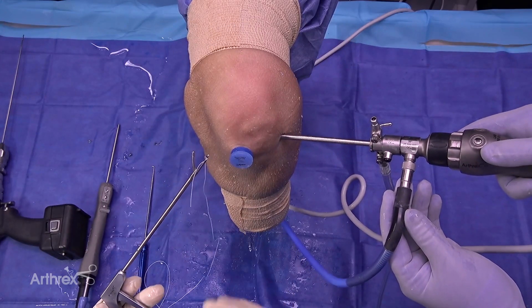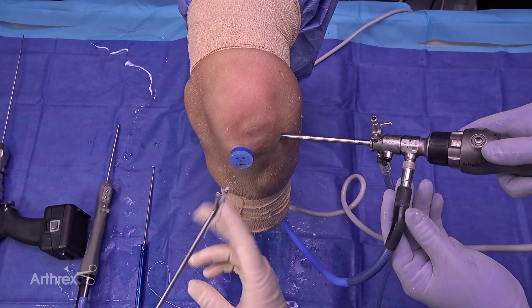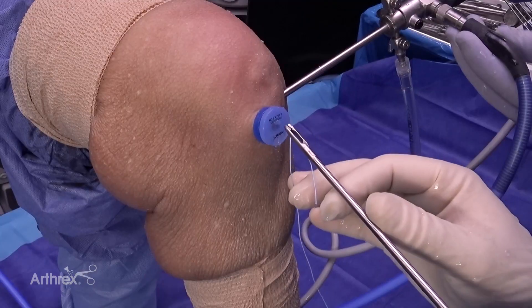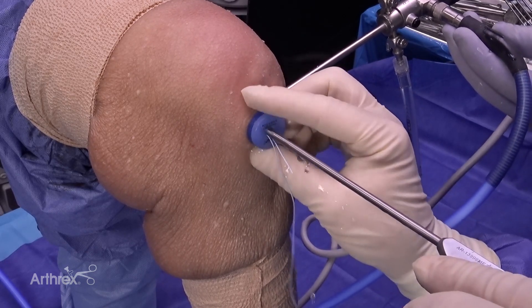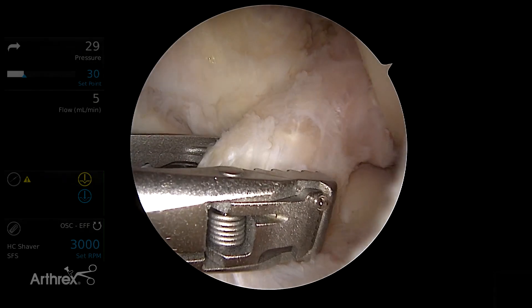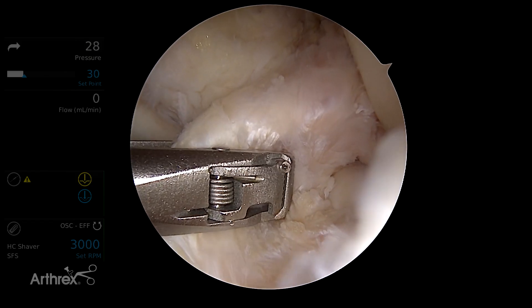First things first, we're going to use the shoulder scorpion fast pass — I've found that one to be the most useful for ACL repair. We're coming through an 8x3 passport cannula, which comes in the kit, and we're going to come through it with a number two fiber wire. I find the fiber wire works best with the round configuration rather than some of the tapes with the flats.